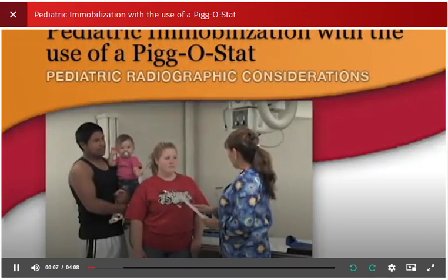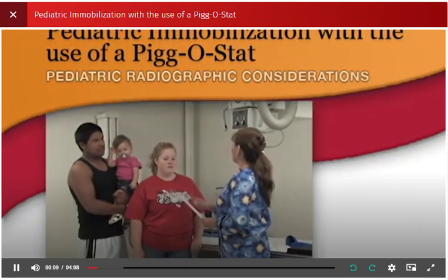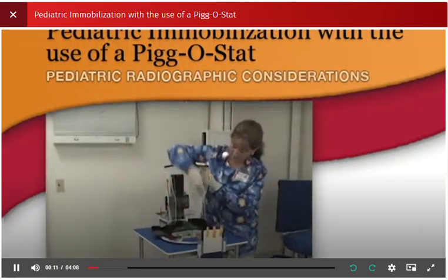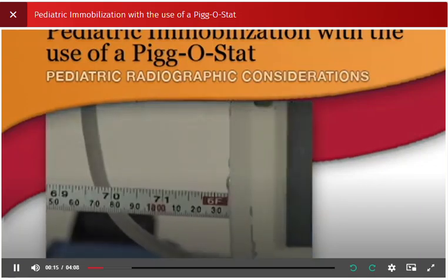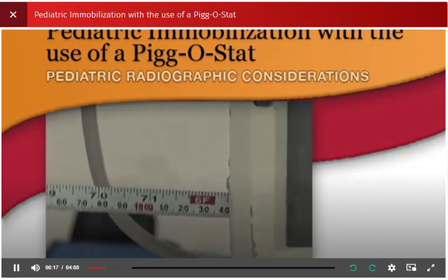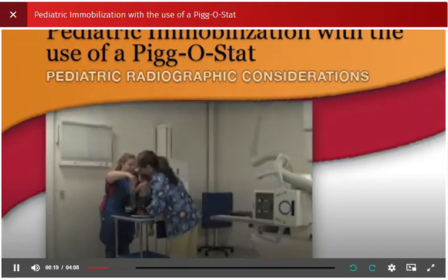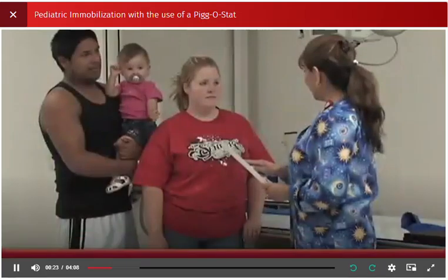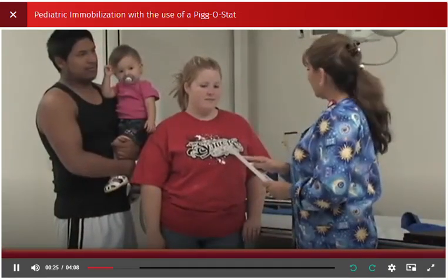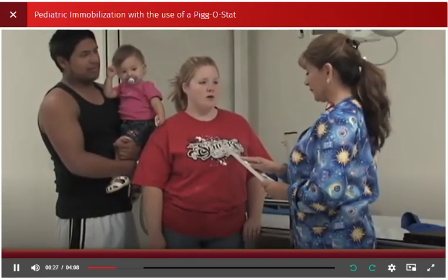As a radiographer, you must use age-appropriate methods of communication and execution of the required procedure to deliver safe and quality patient care. Parents or guardians who accompany the child will feel less anxious if they are given proper instructions and explanation of the procedure. Effective communication with the child and parent is key to a successful exam.